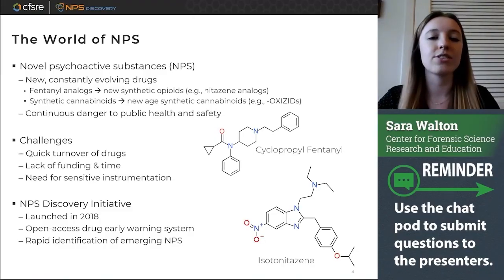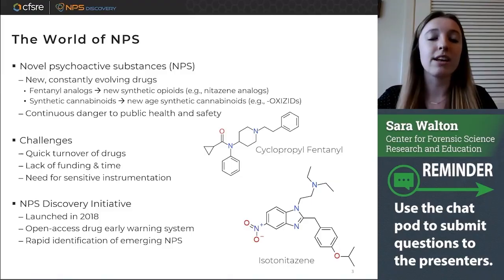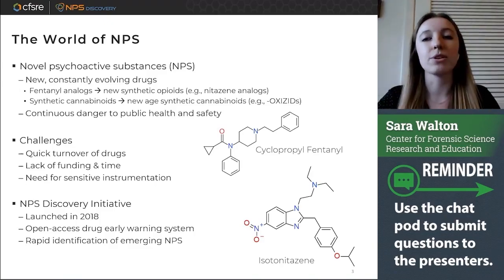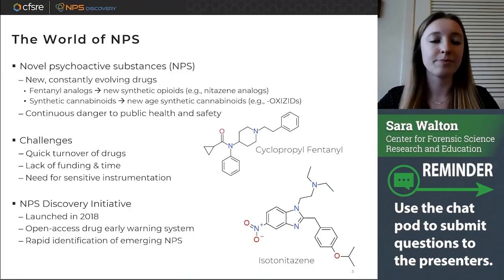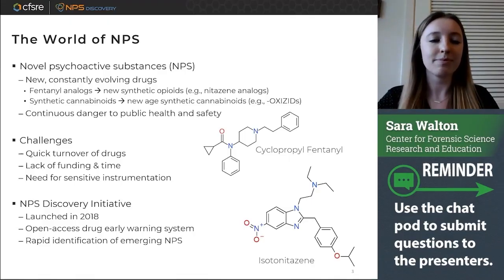Really the biggest challenge is there's such a quick turnover of drugs. A drug could be prevalent on the drug market for a number of weeks or a number of months, but really quick turnover. And most labs or government laboratories have a really bad lack of time and lack of funding to be able to keep up with all these new drugs that keep emerging. As we start to see more and more synthetic drugs come out, a lot of them are more potent than the ones that came before it. So we really have that need for sensitive instrumentation.